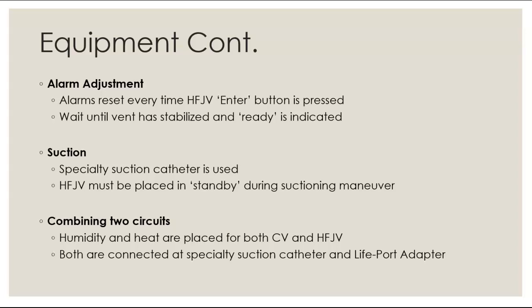Or, if you're old school or in an emergency, if you apply suction on the way down the tube and the way out, you can have an effective suction maneuver. I didn't tell you that. You found that out in other places. Whoops.